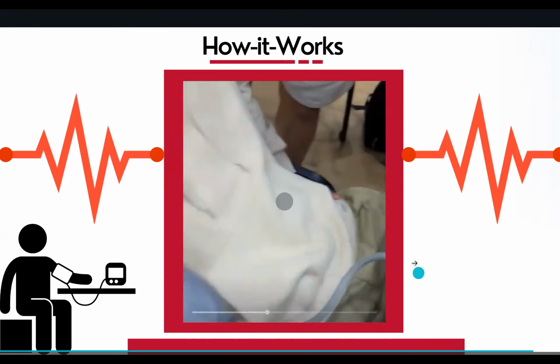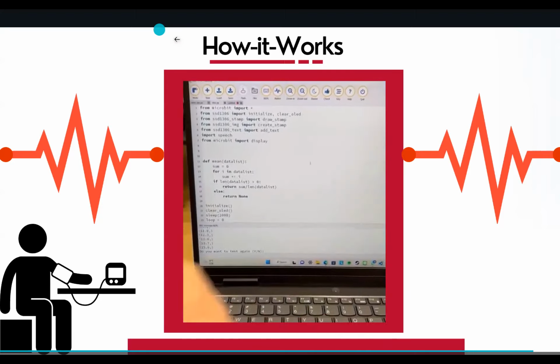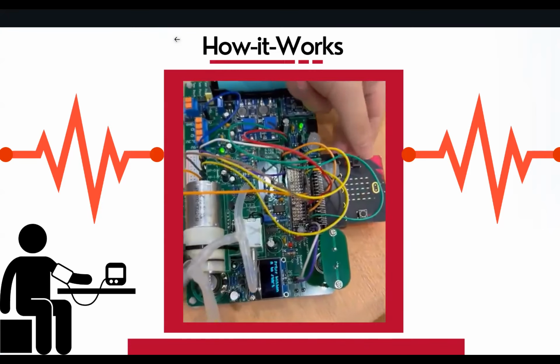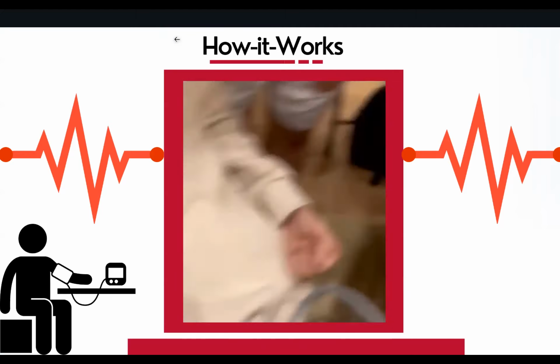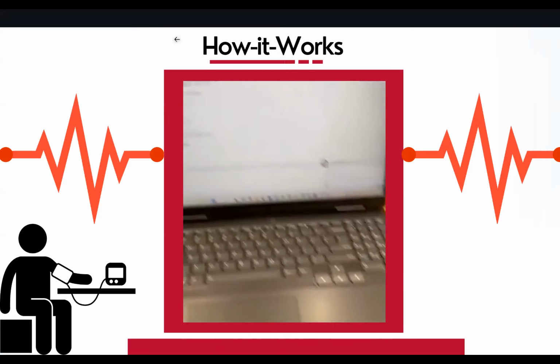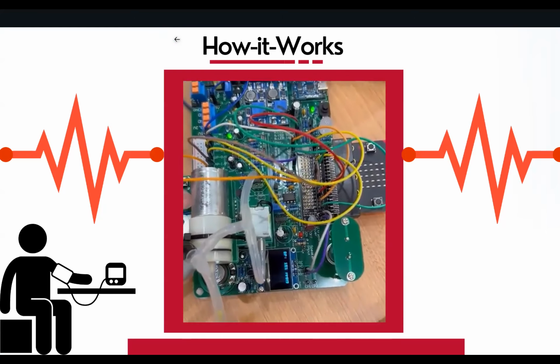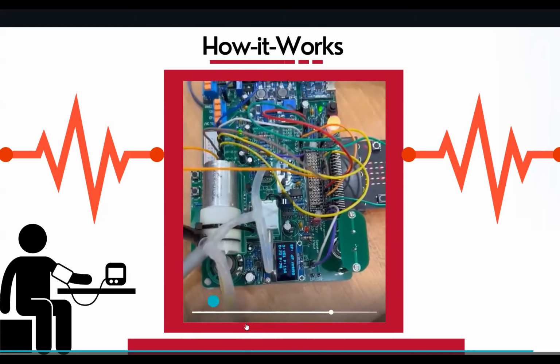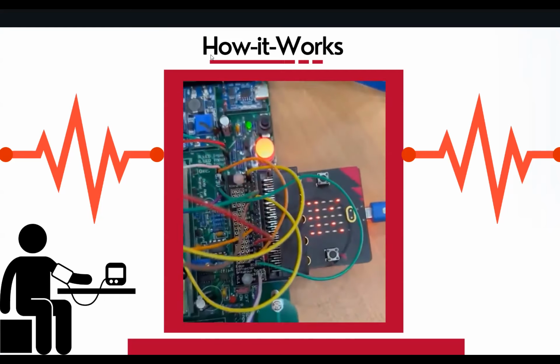It will then classify into the diagnosis and display the messages accordingly. Here you can see the previous systole and diastole recorded from the previous measurement.